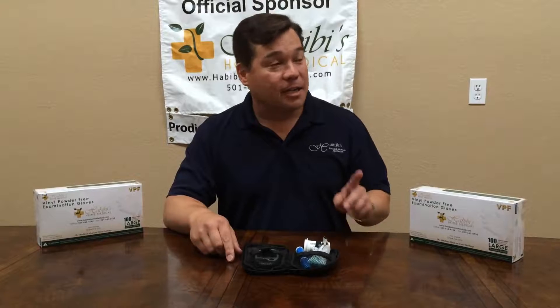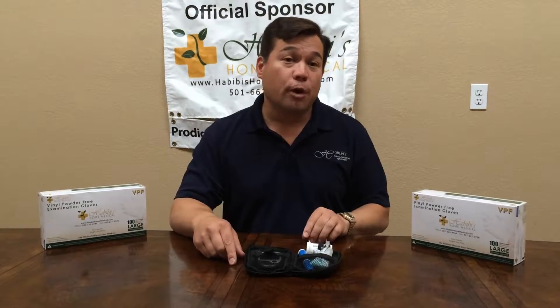Hello, I'm Jeffrey Yamauchi with BB's Home Medical, and today I'm going to show you how to train your visually impaired patients to use the Prodigy Auto Code Talking Meter.